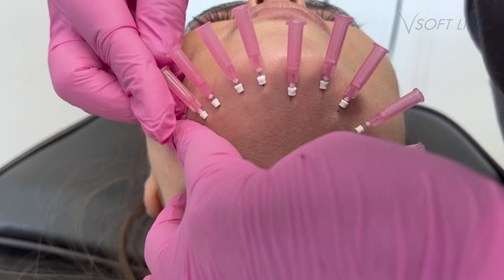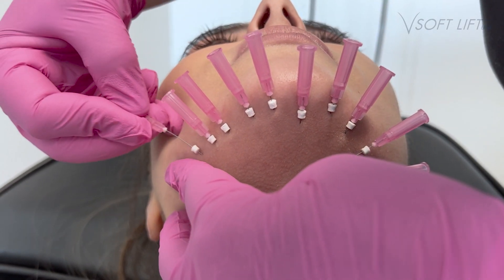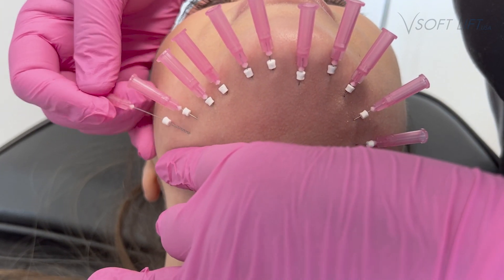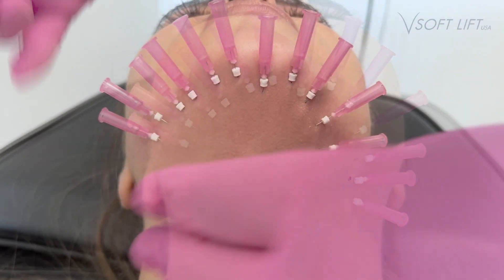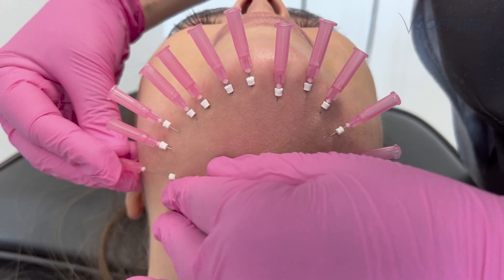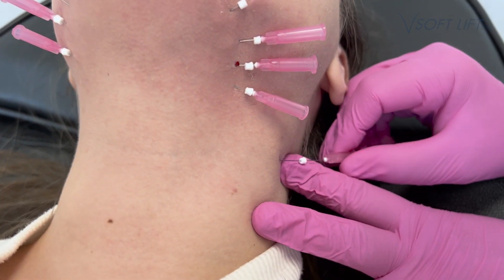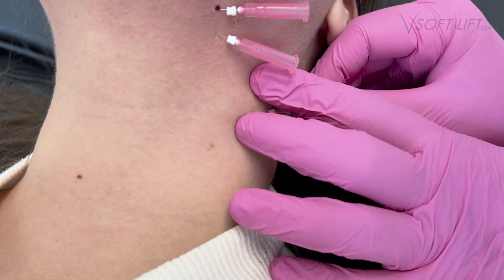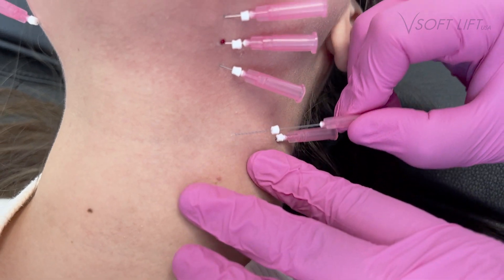You might ask, then why don't I use these for everybody? First and foremost, they are a little bit more uncomfortable for the patient. This patient happens to be a great patient and does really well with pain, so she's not really wincing much. But they are more uncomfortable, and they are a little bit more difficult to place. There tends to be a fair amount of resistance, and it requires a little bit more of a push to place.